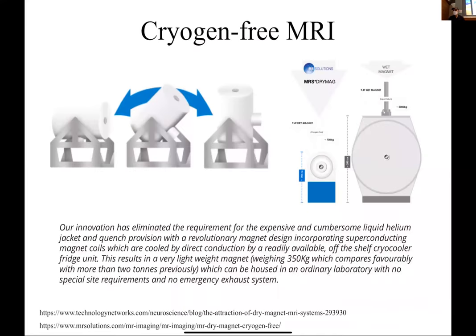One thing that you can do is what's called cryogen-free MRI. So one of the disadvantages of these magnets is you have to have liquid helium, which is a limited resource and very expensive and requires a lot of sophisticated technology to keep it there. So there is this, especially for smaller magnets.